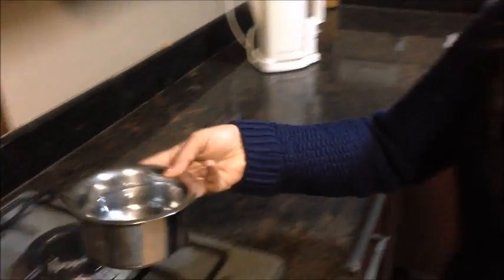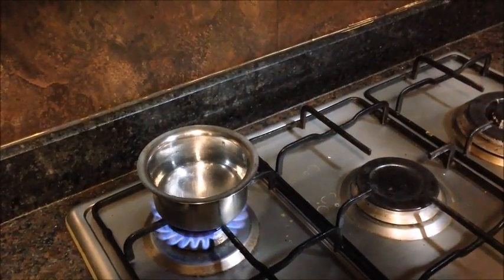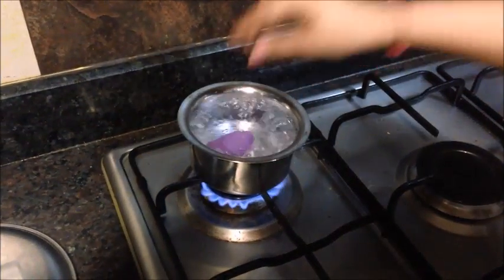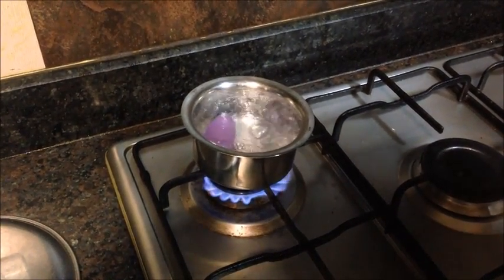Let's start with boiling the cup on the stove. I have water in this little pan here and I'll bring it to boil. Once the water has come to a boil, you can immerse the cup inside and let it boil for about 5 to 10 minutes.